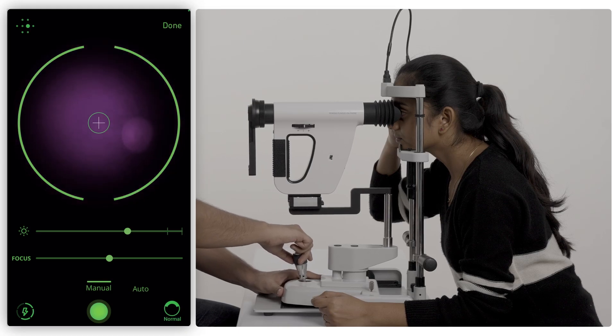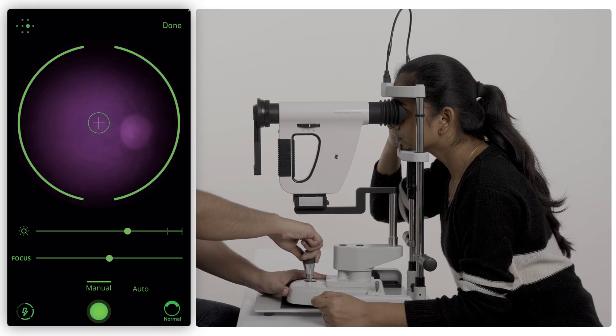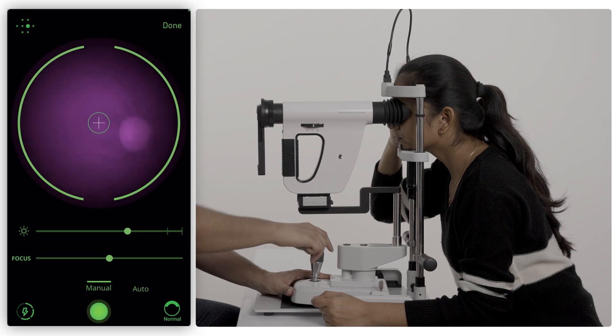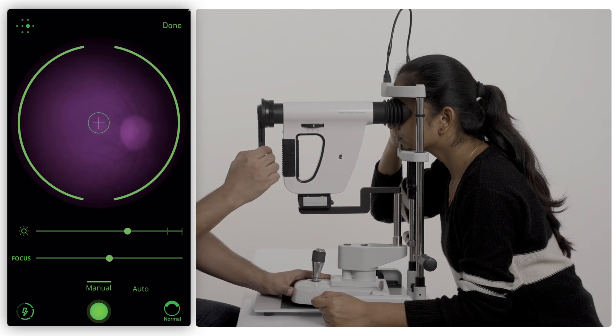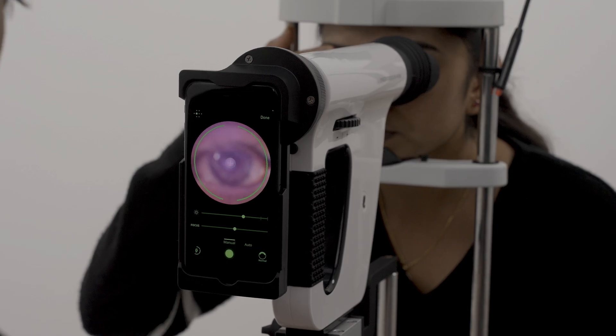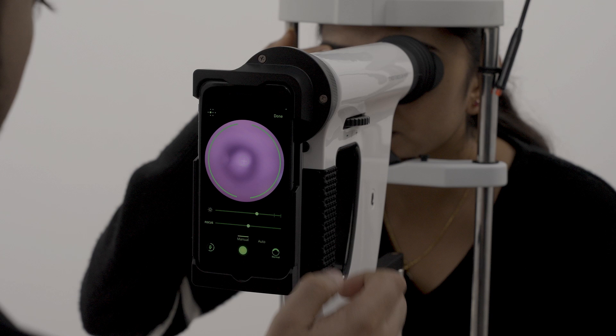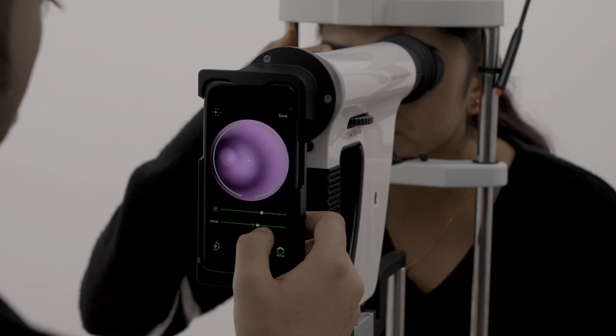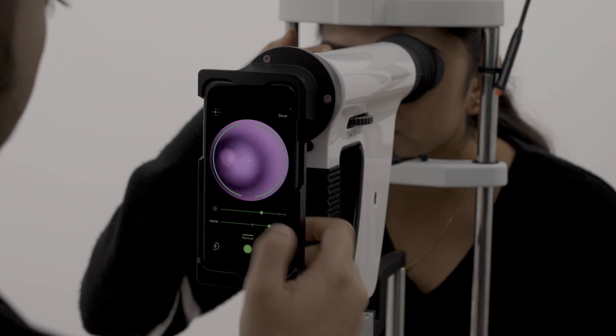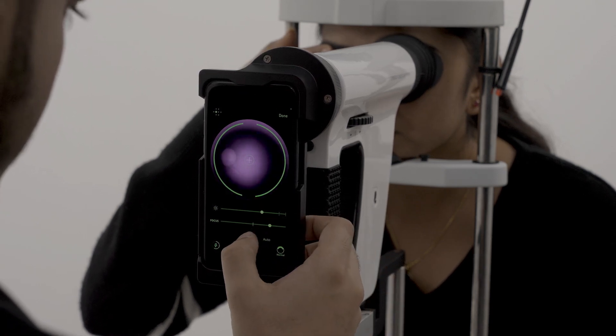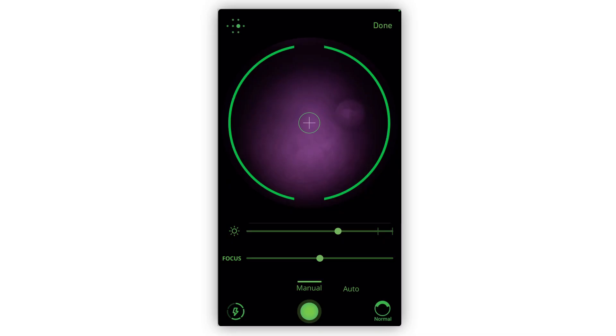When the green circle is filled, click immediately to capture an image. When you're using FOP in chin rest mode, it's easier to use the on-screen controls. Instead of clicking the trigger button, tap on this button to capture an image.